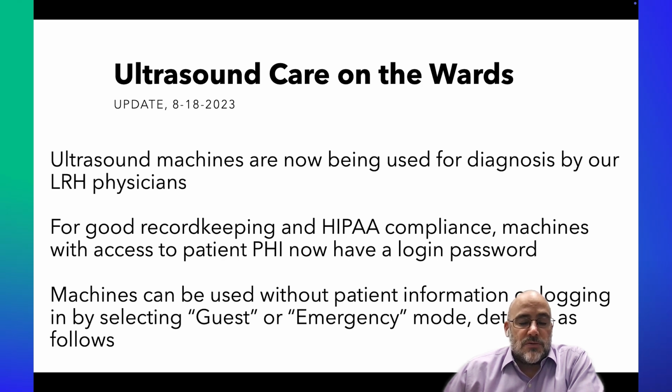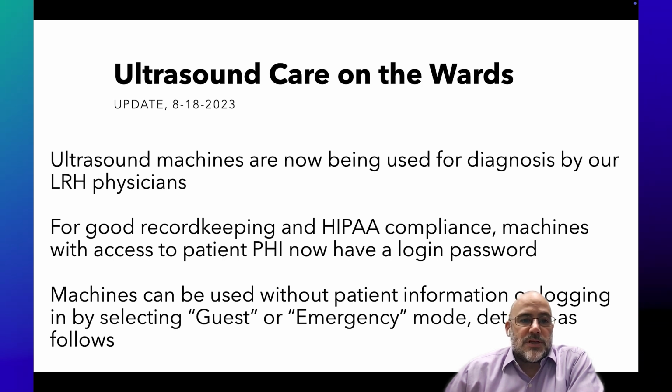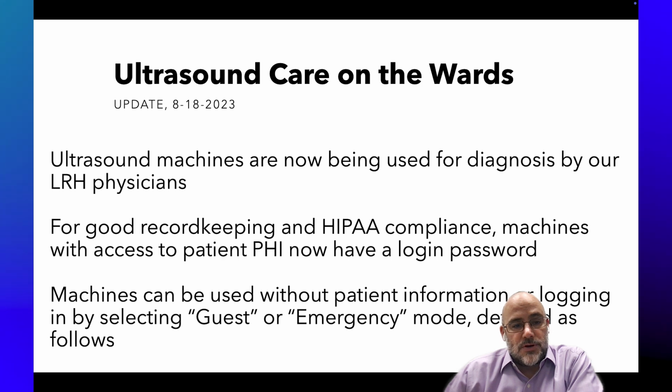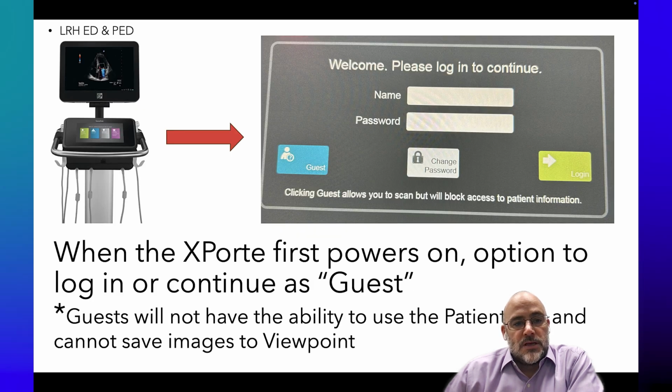Every machine can be used in an emergent situation, but without logging in or putting in patient identifiers, by simply choosing the guest or emergency mode, which you'll see on the screen when you start to boot up the machine. So here's an example of that using the Sonosite, where you can just click the blue guest button there and bypass any need to log in.